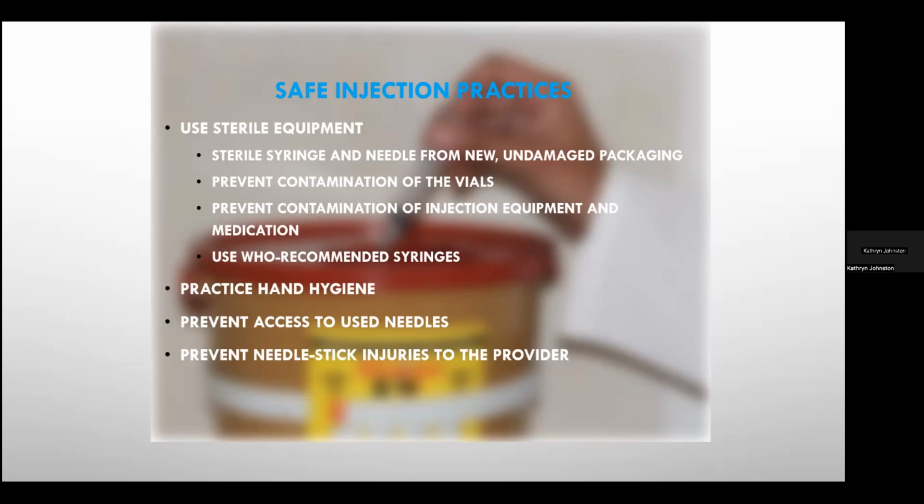Disinfect the skin. So again, using 60 to 70% alcohol-based solutions, either a single-use swab or an immediately moistened cotton wool ball. You should never see cotton wool balls in jars or in cups of alcohol. What happens is that with hands going in and out, the alcohol loses its potency and the cotton wool balls actually become contaminated. And so it is possible that you can cause infections in people if you don't use a freshly soaked cotton wool ball.